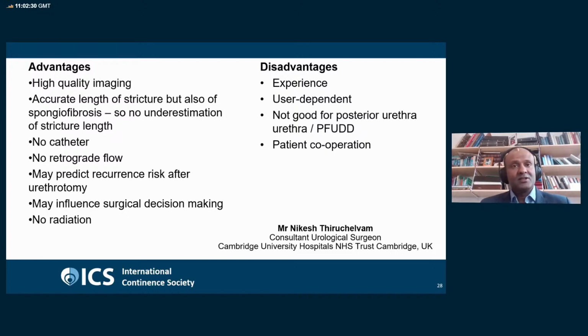And of course, there's no radiation involved, especially important in young children where the testes are close by. There are, of course, some disadvantages. It's very much an experienced technique. You have to be experienced in ultrasound, experienced in being able to obtain good images, know how to twiddle the knobs on the ultrasound machine, and also be able to converse with the patient and describe what you need them to do. So it is user dependent.